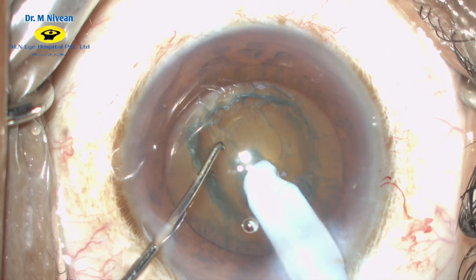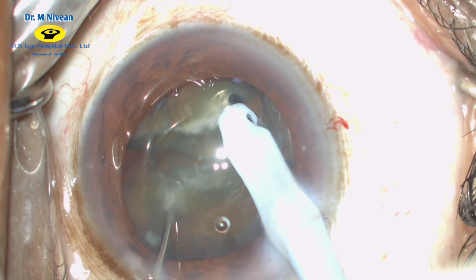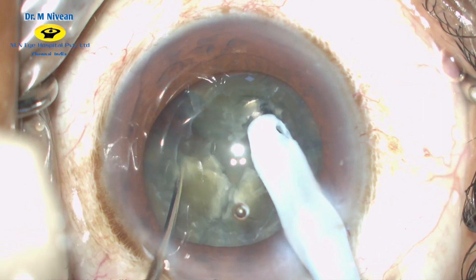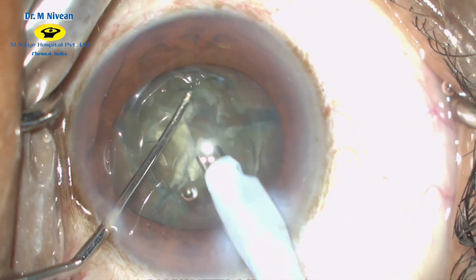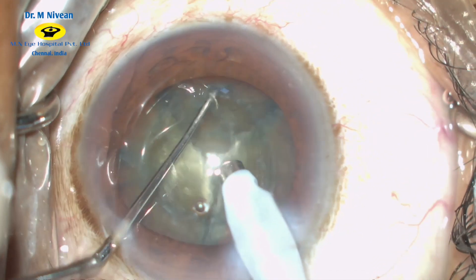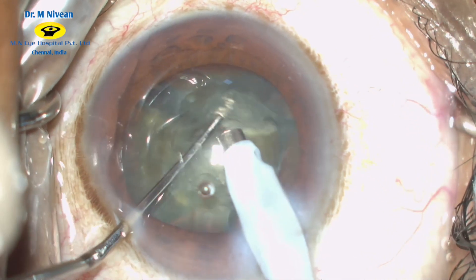The phaco tip is buried under the core of the nucleus and the direct chop is initiated. You can appreciate the splitting of the nucleus. With the same hold, the second chop is initiated. Rotating the nucleus 180 degrees, the last chop is also completed.